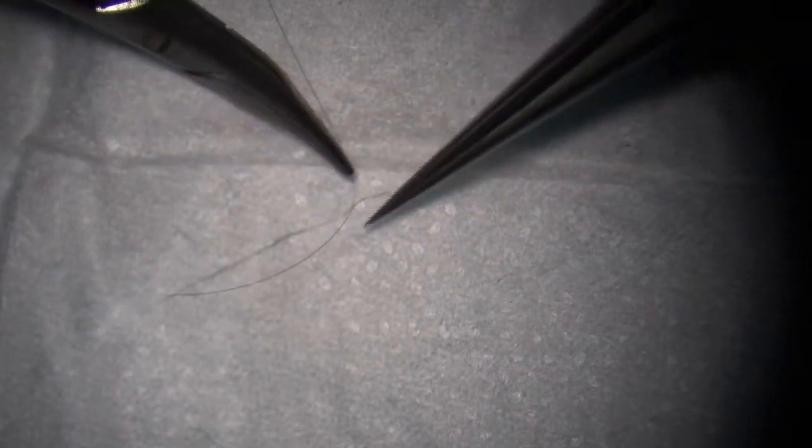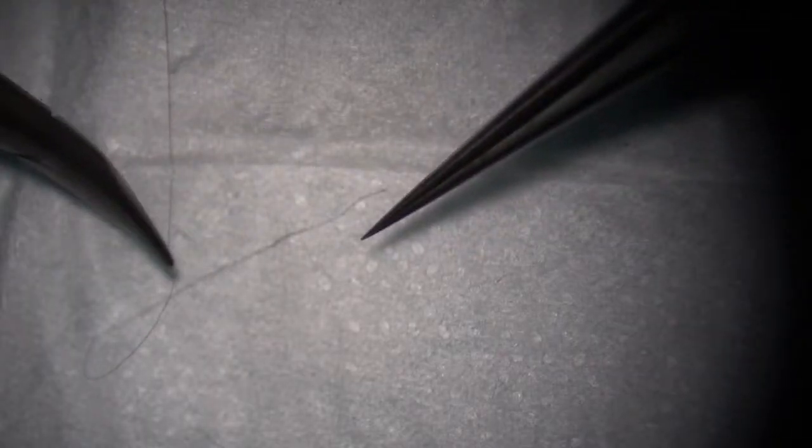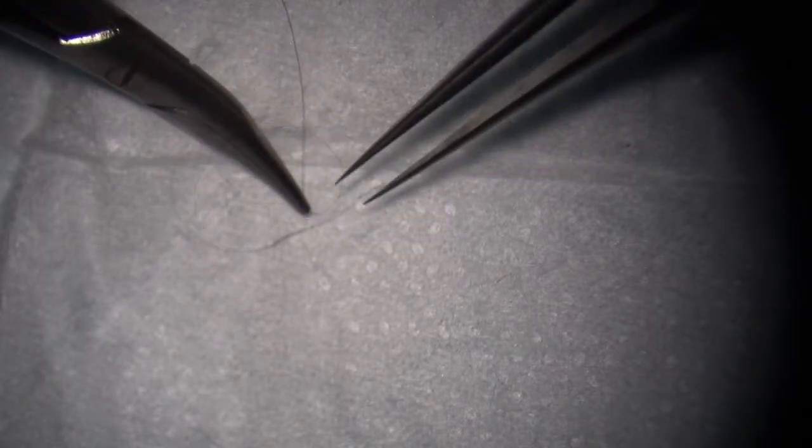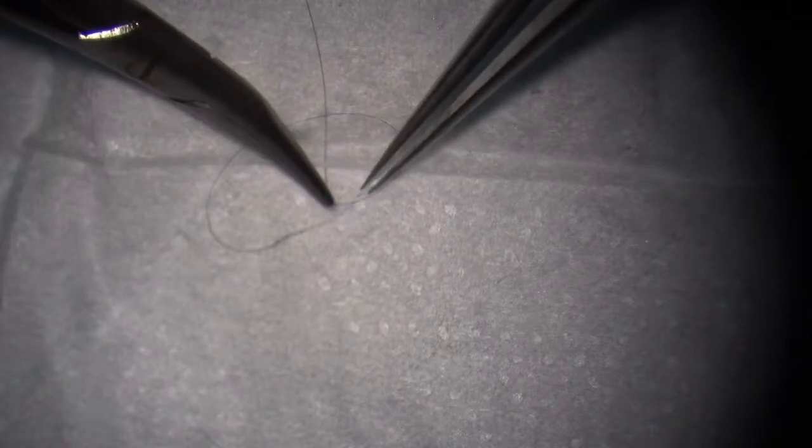And then for the second knot, we pass the suture and tie a knot. If we don't pass the suture and we're already good, we can just go straight for the next knot. We bring it here and make a loop. When we make the loop, we bring the suture very close to the short end. So we make the loop and catch it, it's already down there. So you're not traveling that much further distance. Yeah, correct. Nice. If we stay here and make the loop, then we need to travel far and you could lose it, yeah. So we bring it here, make the loop, and then pick up. That's the way of being efficient.